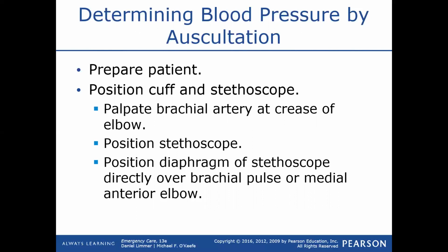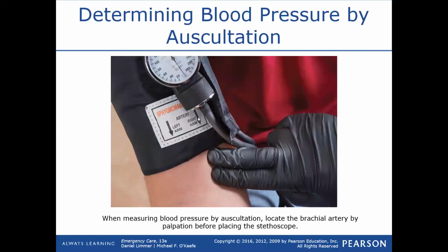But we're going to get our stethoscope ready. We're going to get our blood pressure cuff in the right place. And we don't need to overthink this either. It's a very simple process to do. I know there's a lot of steps that we're listing here.